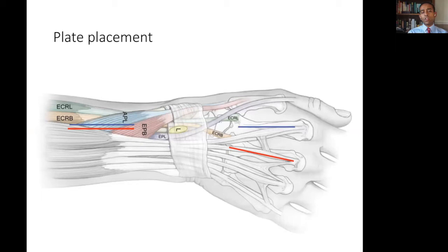Note that both require exposure of the interval between APL and EPB and the ECRL and ECRB tendons for exposure to the radius. The benefits of using the index metacarpal are that it can adequately buttress displaced scaphoid facet fragments, and also it can avoid irritating the EPL tendon, which can sometimes occur when using the middle finger metacarpal. The bonus of using the middle finger metacarpal placement is that it can buttress the dorsal fragments of the lunate fossa much better, and also avoid potential risk of injuring more branches of the superficial radial nerve, which are more commonly found over the back of the index finger metacarpal.